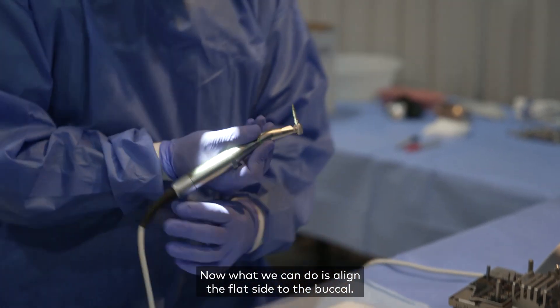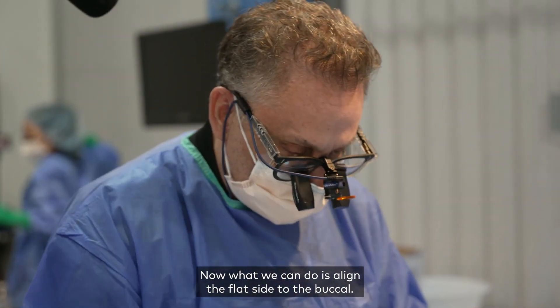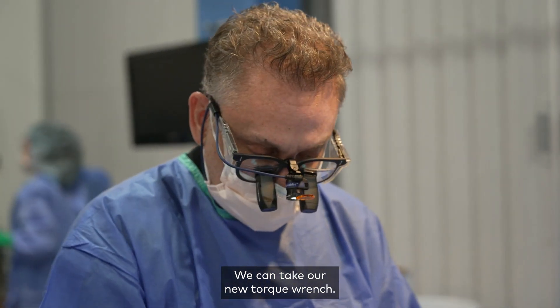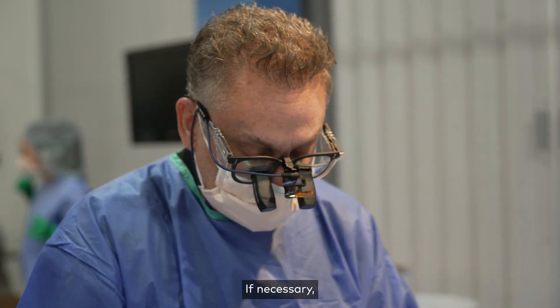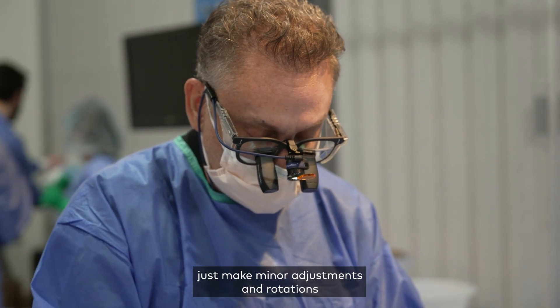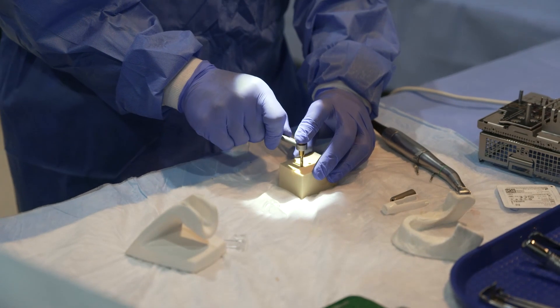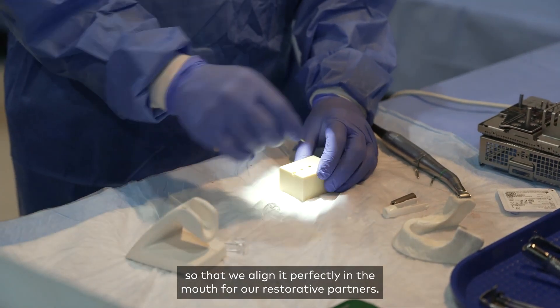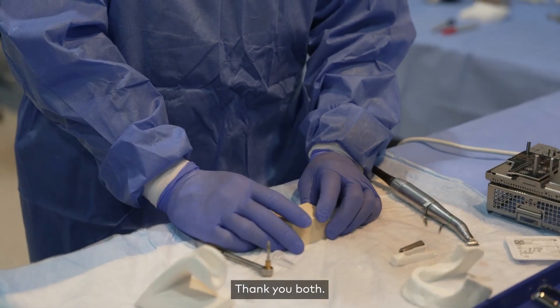Now what we can do is make sure that we align the flat side to the buccal. We can take our new torque wrench and our implant mount, and if need be, just make minor adjustments and rotations such that we align it perfectly in the mouth for our restorative partners. There we have it — thank you, Bill.